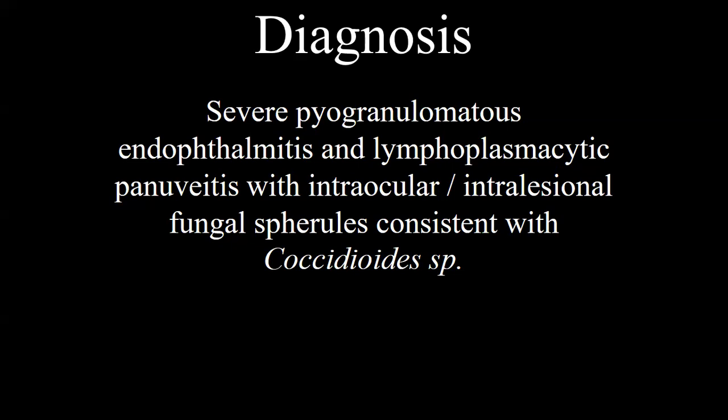Yeah, that's useful. And we actually recently did IHC for, oh gosh, was it TTF1? On a series of these, and it was actually a relatively small percentage that had positivity for TTF1, which is supposedly a marker of pulmonary respiratory carcinomas. Obviously, it's also a marker for thyroid carcinomas, but anyway, that was kind of an interesting finding, that so few were positive.